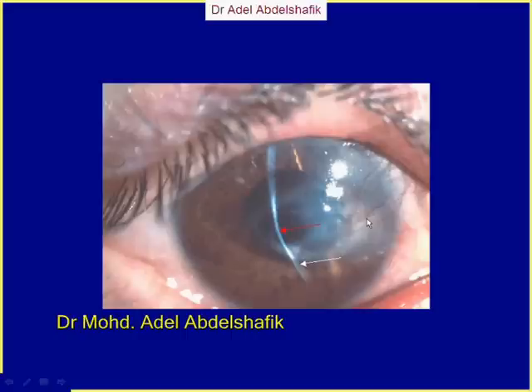So this is superficial vascularization, because we can follow them to the limbus on the surface of the sclera, they are not interrupted, and again because they are wavy and branching. Now we notice the section here. You see the thickness here and the thickness there. So this part is thinner, okay?